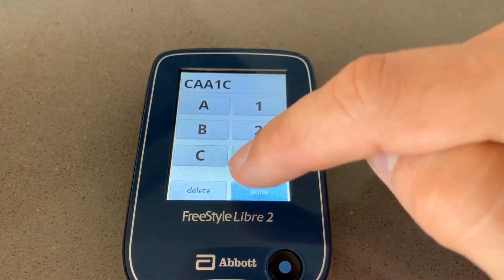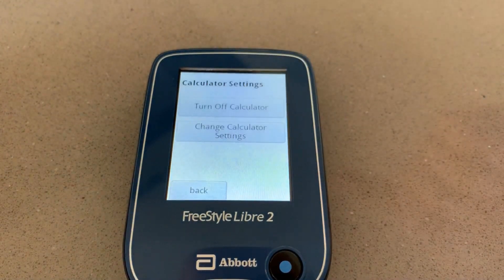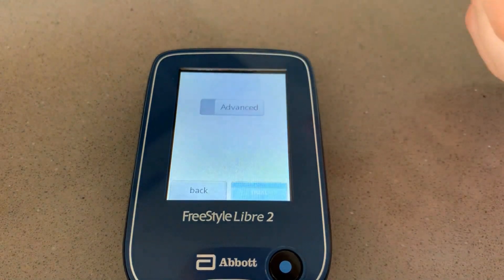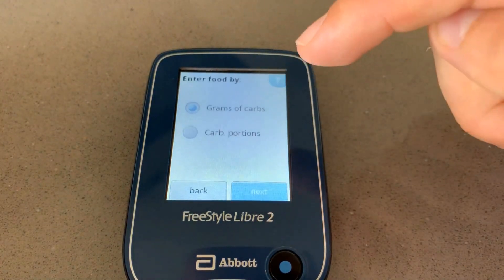Click on the insulin calculator and you can set up your insulin-carb ratio, your insulin sensitivity, your target glucose, and so on. If you don't fully understand these things, please have your healthcare professional do this for you. If you use your Libre reader to scan the sensor and also use your phone, always activate the sensor with the reader first. If you activate the sensor with your phone, the reader will not work. So activate with the reader and then connect your phone.